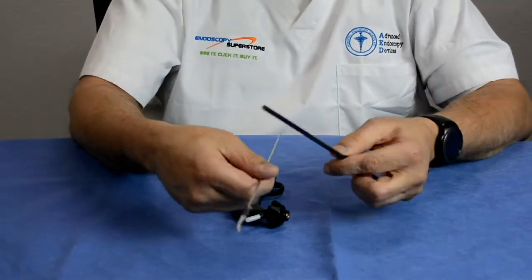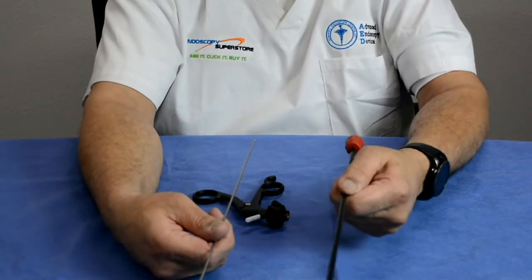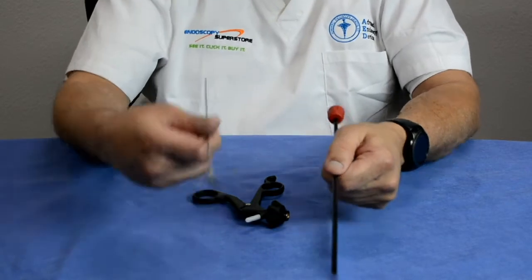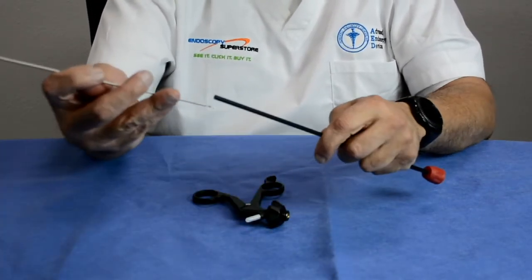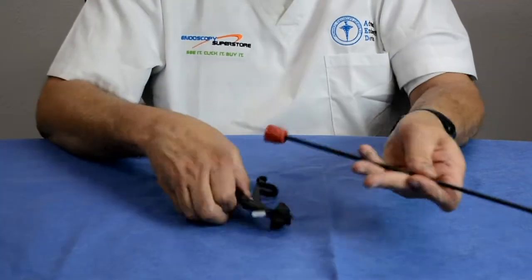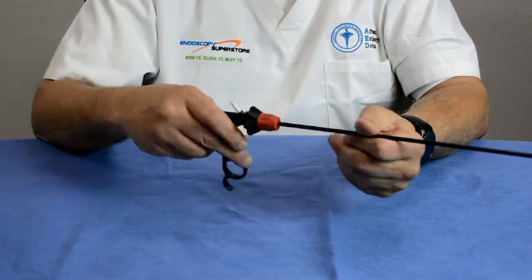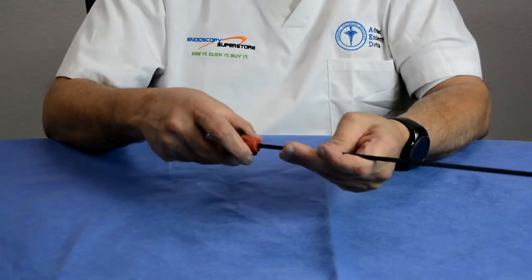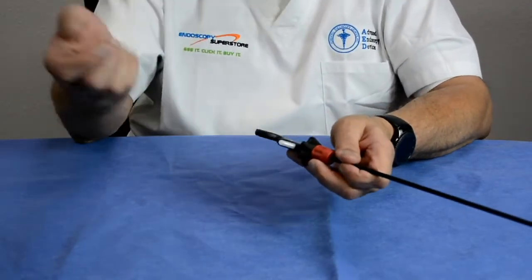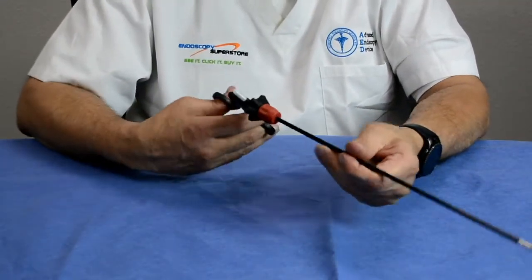These modular forceps are economical. If the jaw insert or insertion shaft gets damaged, you only have to replace that component — no need to send it back or wait for a repair technician. You can keep extra components on hand and interchange them in your SPD department. They also come with colored rotators, so during a case you can have red for a Maryland forcep, green for a scissor, blue for a grasper, and orange for a retractor. There are two styles of handles — standard and ratchet — both easily interchangeable.